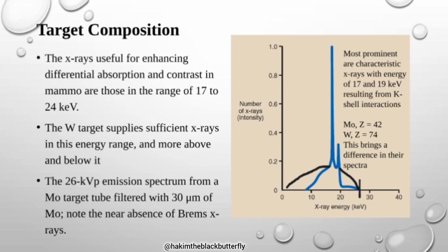Members, is that making sense to you? I don't want to go away from this when you haven't understood that. Okay, all right. So that is the reason why higher energy photons can also be suppressed. The low energy photons are absorbed in the filter, but also there is suppression of high energy photons. We normally use a molybdenum filter when we want X-rays in the range 17 to 19 kilo electron volts.